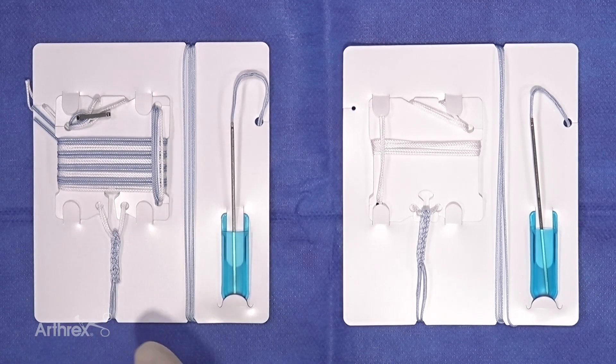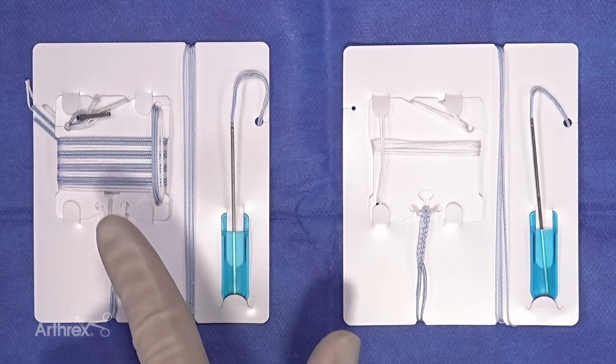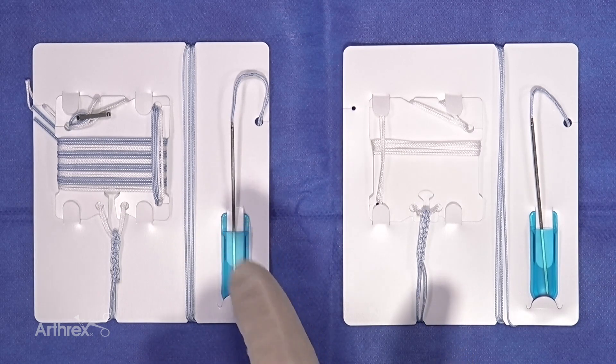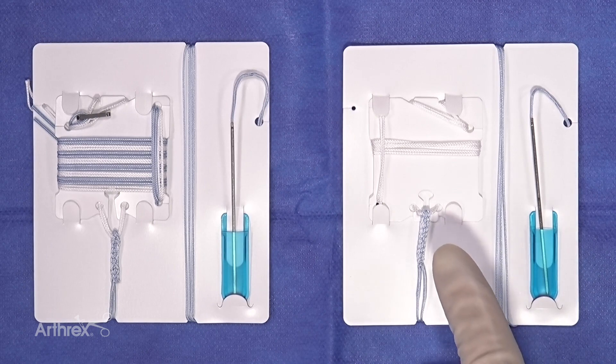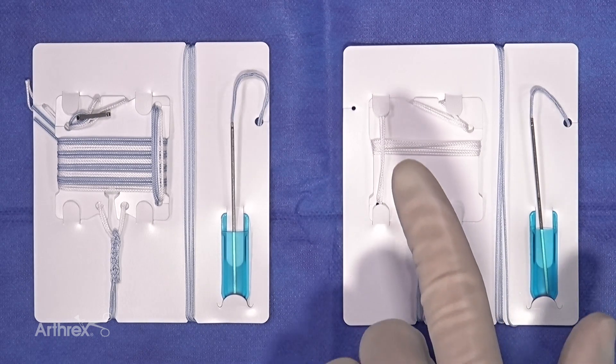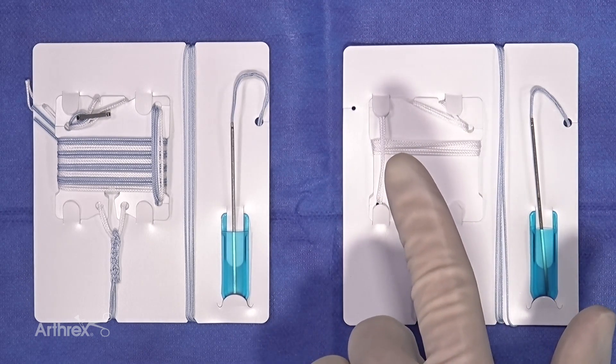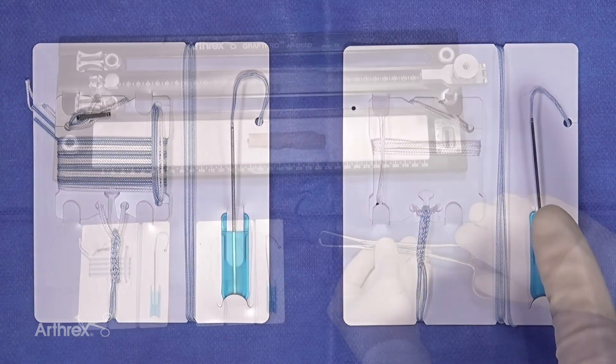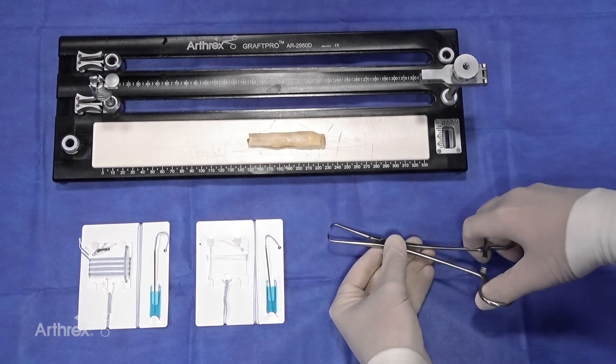We have a nice stout needle which could pierce the graft very easily. Over on this side we have the fiber tag ABS, and this is all attached together again, making it very easy to use and eliminating steps. Here we have the graft clamp, this is specially designed to hold the graft and also the fiber tag system.